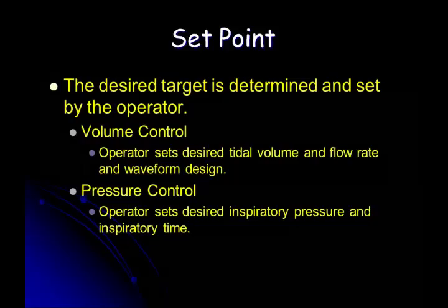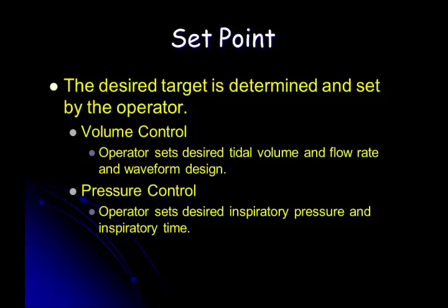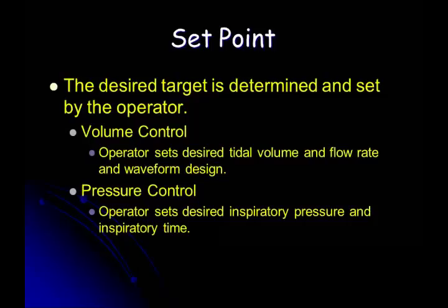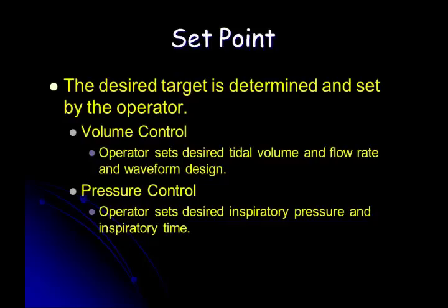I can also have a set point to say, no, I want a specific pressure delivered. Each and every time that ventilator turns on and delivers a breath, I'm fixing a pressure. Volume and flow are variable. Actually, I not only set a pressure, I have to set an inspiratory time also. But we'll get to the specifics of these as we go along.